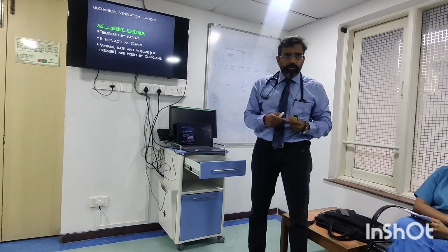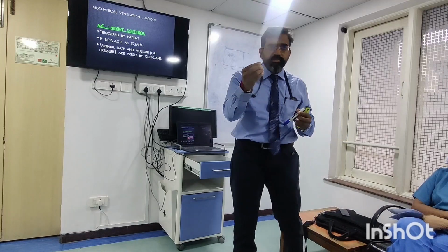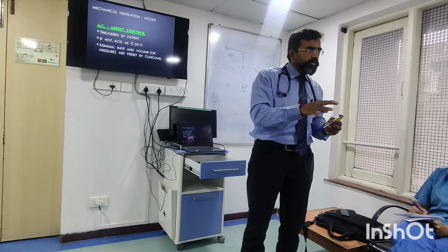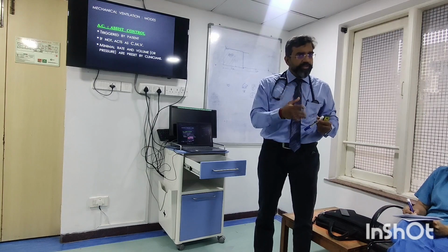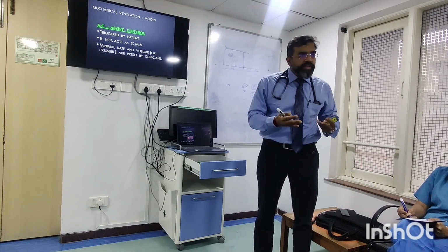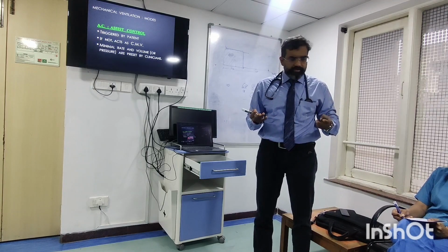Now what is assist control? The word assist means now I am delivering some amount of assistance and patient can assist this kind of breath. Okay, so in this case, the trigger would actually be by the patient. That is what is assist control. If the patient doesn't trigger, it will be time triggered.